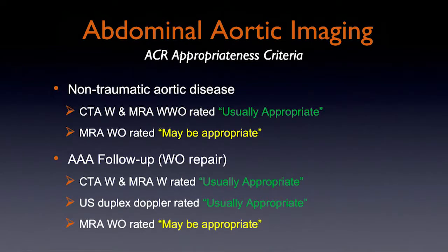So what about applications, established applications, and when to use MR angiography in the abdominal aorta? Well, the reality is CT is a major competitor, right?